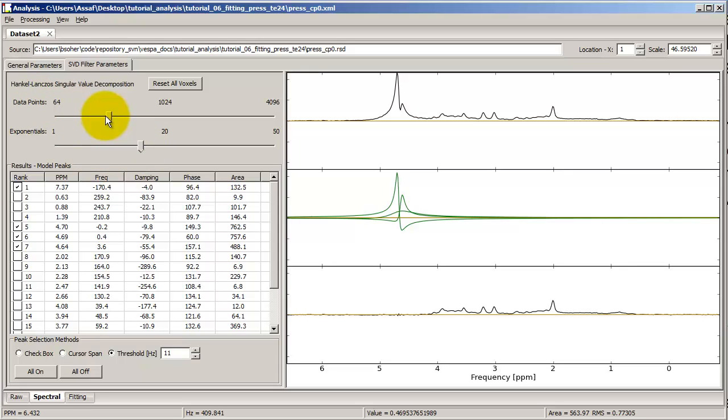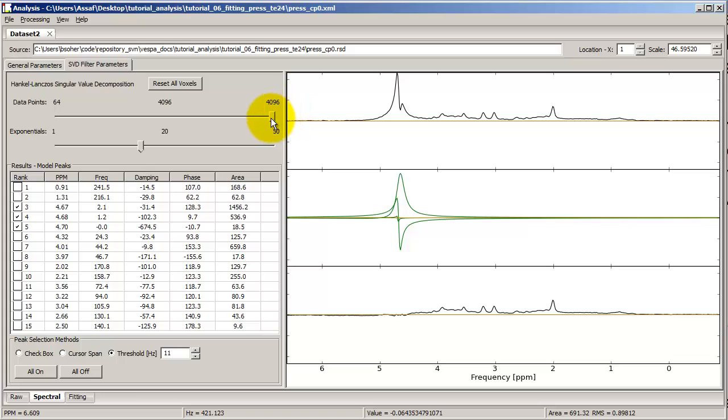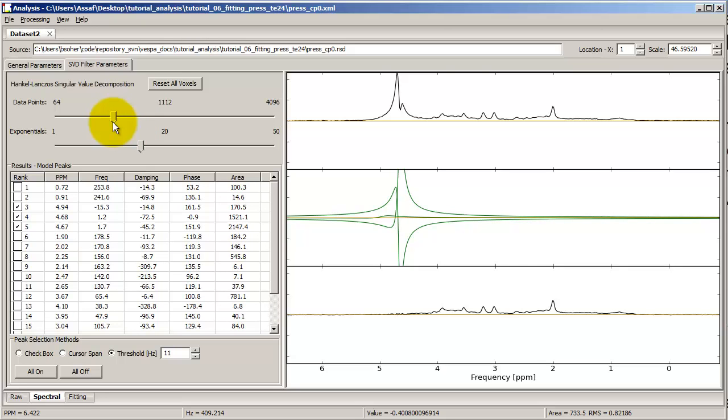Data points means how many points from your FID you want to use to estimate the Lorentzians that make up your spectrum. Use too few and the algorithm doesn't have enough data to work with. Use too many and you're introducing probably too much noise and making the estimation a little less accurate. Okay, I can just pull it up all the way here to 4096, and it actually works fairly well. It's pretty robust. It still makes out the water peaks, but it's probably a good idea not to use too many, just so you don't introduce noise, and maybe for larger data sets it makes the processing slightly faster, but not substantially.